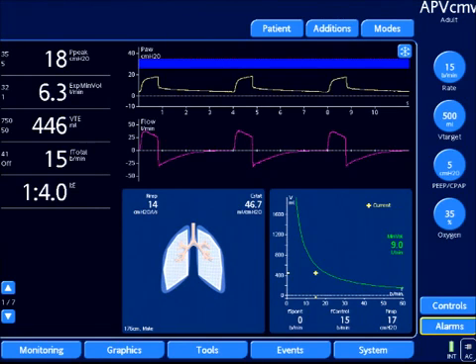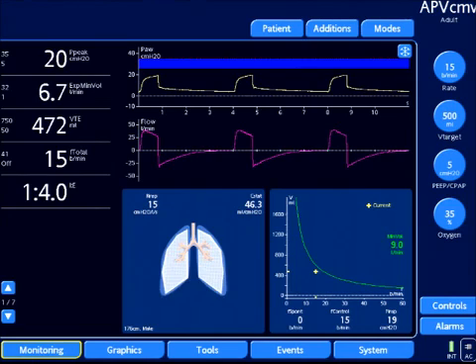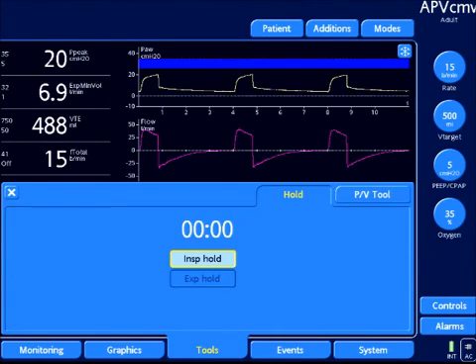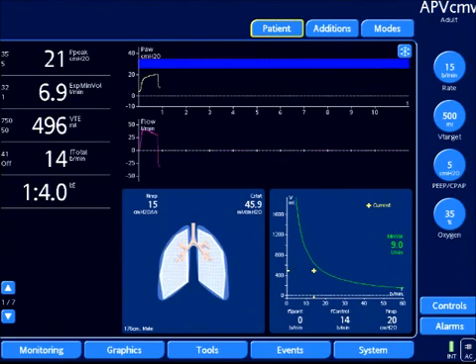You can also obtain a plateau pressure during adaptive pressure control ventilation, otherwise known as PRVC or AutoFlow. I'm going to look at my monitoring tab, and you see my peak is 19, my plateau is 19. However, this is false. This is a pressure control based mode, and if we look at my flow waveform in purple, it's not fully decelerating, so they shouldn't be equal. I'm going to do an inspiratory hold to show this difference. I'm going to do the maneuver. It creates an inspiratory hold. I'm going to trace over with the cursor and see my measured value of 15. So my plateau is 15, quite different than the 19 or 20 centimeters of water of my peak airway pressure.